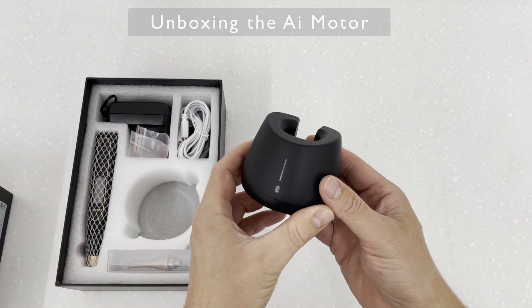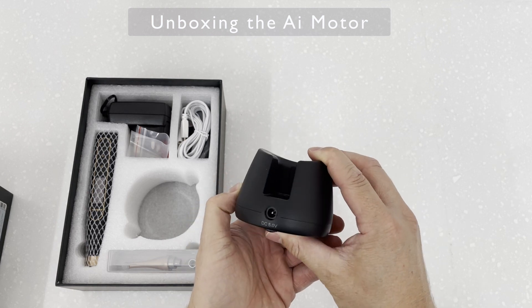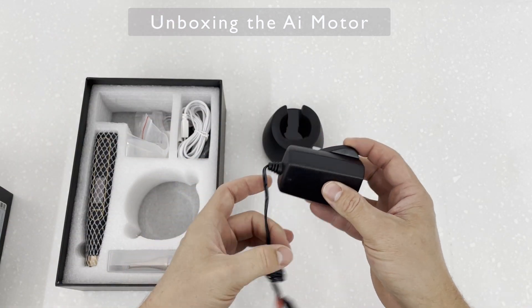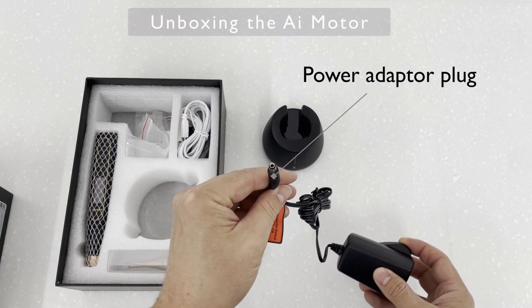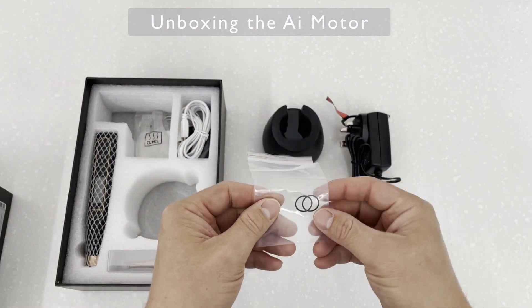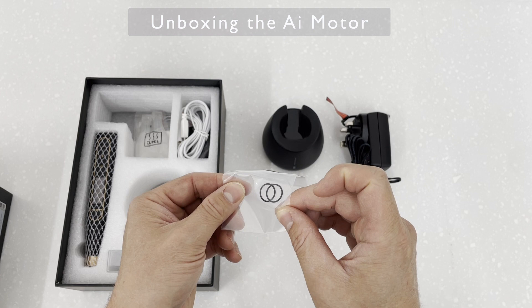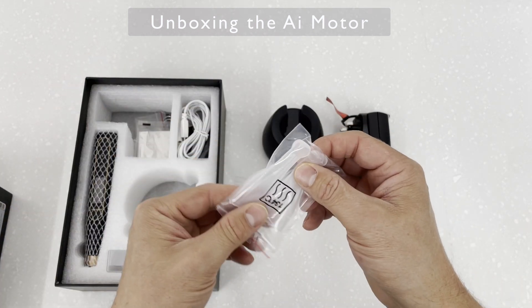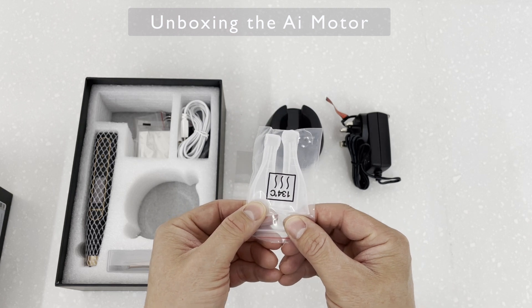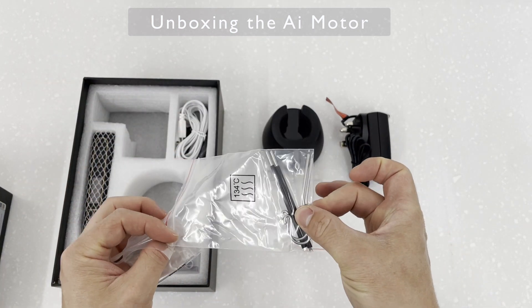You get a charging base and a 3-pin plug. There are some O-rings — I'm not too sure what they're for, so if you know, please let me know. There are some autoclaveable handpiece insulation sleeves used for the Apex Locator, and two lip hooks and two file probes also used for the Apex Locator.